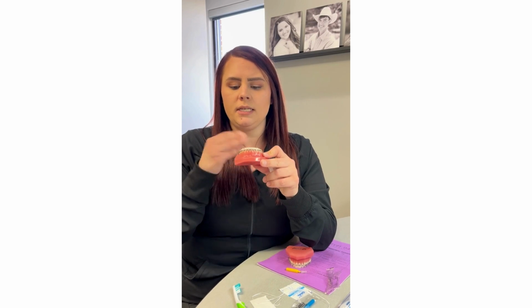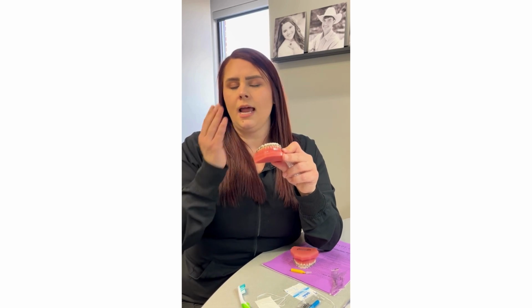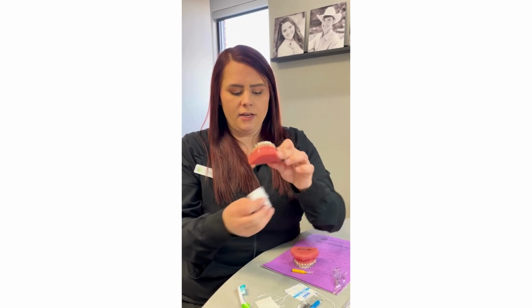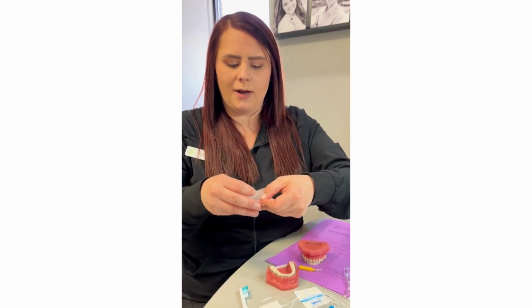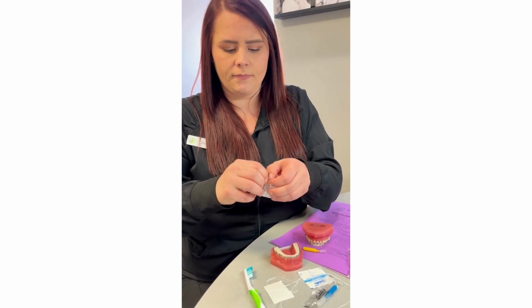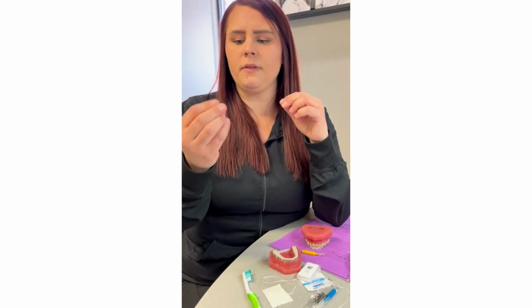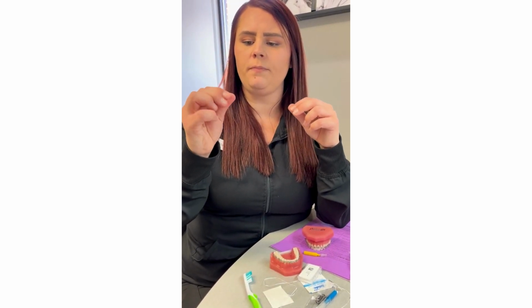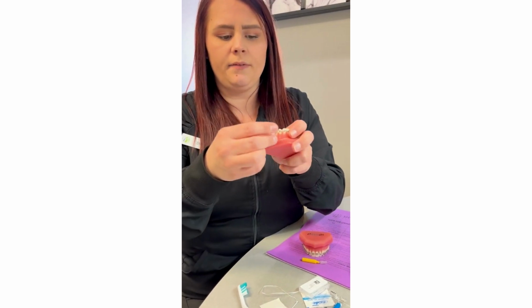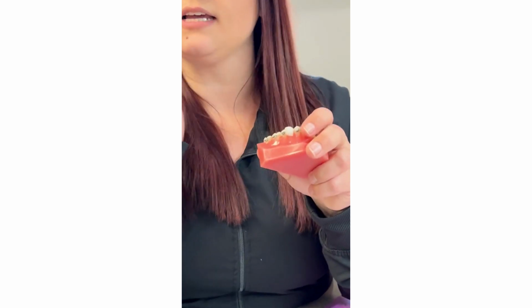One thing that you need to make sure you're doing if you're using the wax is we want you to dry that area as best as possible. You can use a paper towel, you can use a cloth of some sort, and you just want to dry that area. Then you're going to take a small piece of wax from your kit here. And then the warmth of your fingers will help you roll it into a little ball. And then you're going to take the dried area and you're just going to form that wax over top of it. And that will stay there until you remove it.